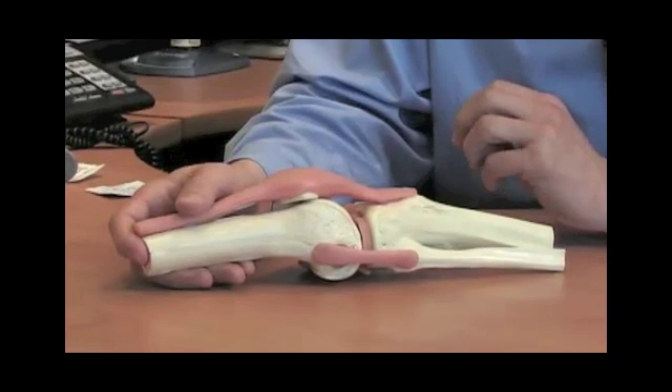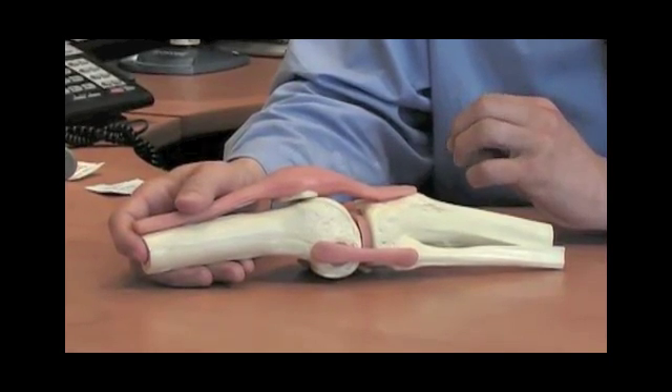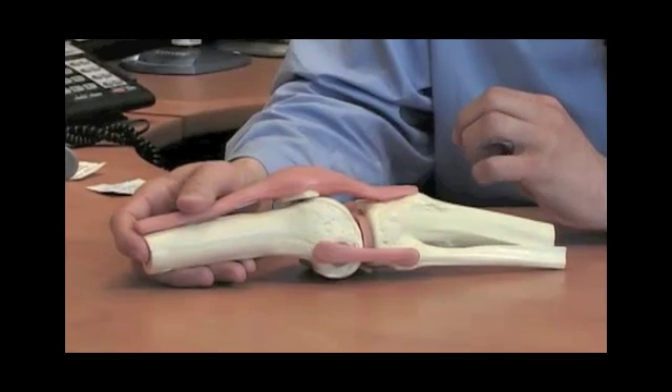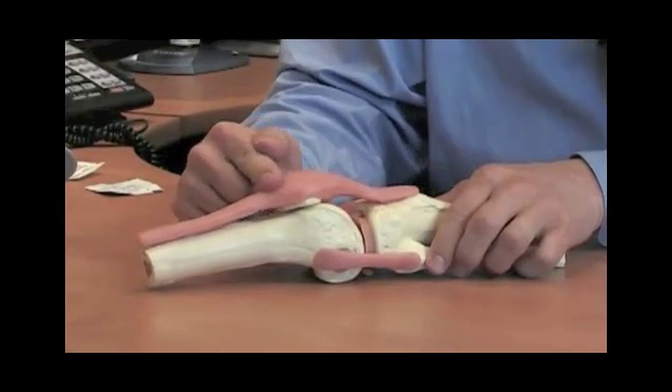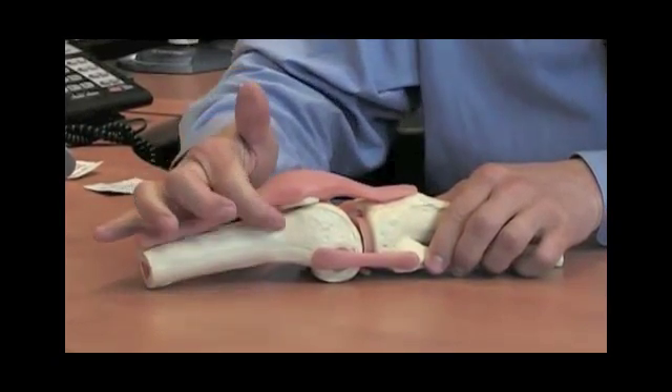My first step in the injection is to localize correct needle placement. I utilize the superior lateral approach. I take a marking pen and draw a line from the superior portion of the patella towards the lateral side.